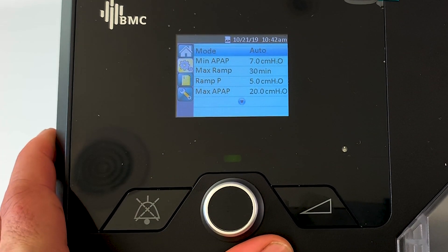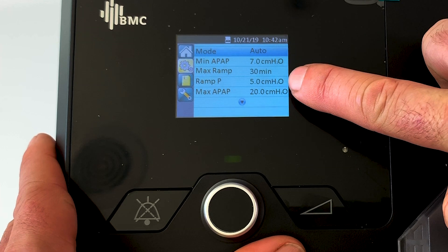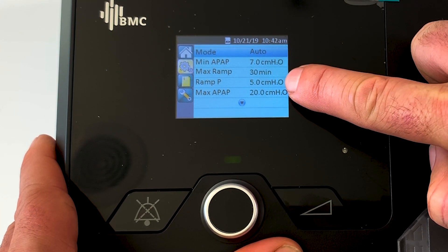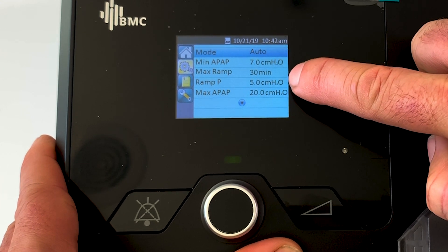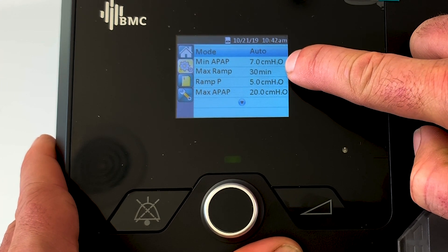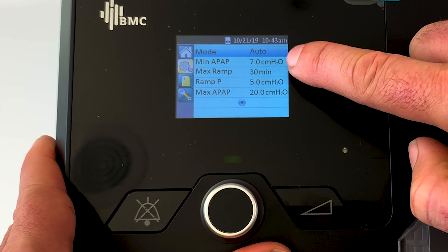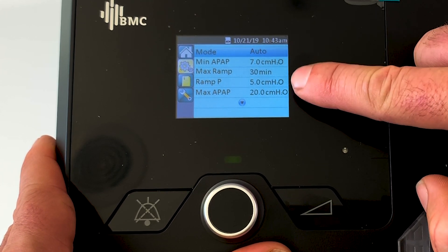Currently the ramp pressure is set to five, which means the machine is going to ramp up from five centimeters over a set time period - going 5.0, 5.1, 5.2 - up to whatever the minimum pressure is. So over 30 minutes the machine will go from five all the way up to seven. Once that 30 minutes is up, the machine will then operate between seven (the min) and 20 (the max). It won't go below seven and it won't go above 20.